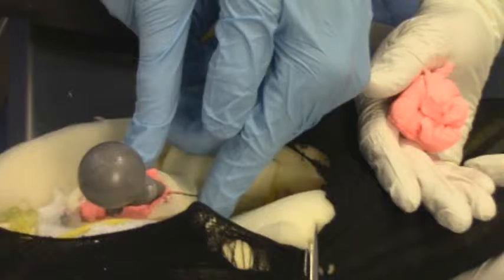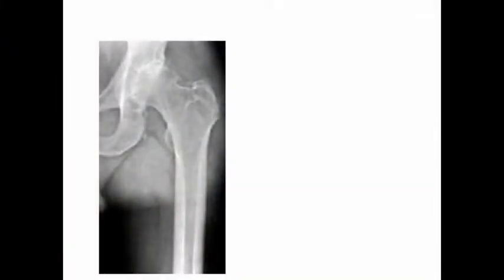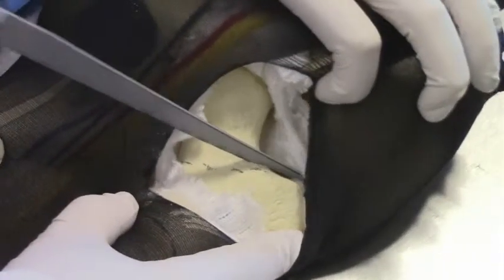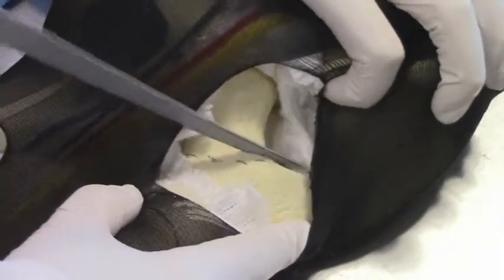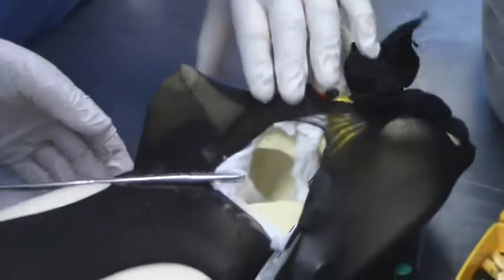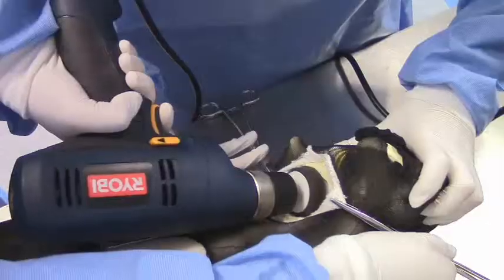The overall process is to cut off the neck, ream the acetabulum, and drill the proximal femur to expose the medullary canal so we can implant the artificial joint. To expose the hip, make a skin incision along the proximal femur and cut the capsule along the neck. Saw along the base of the femoral neck just medial to the intertrochanteric line. Externally rotate the limb and you will be staring right at the acetabulum.